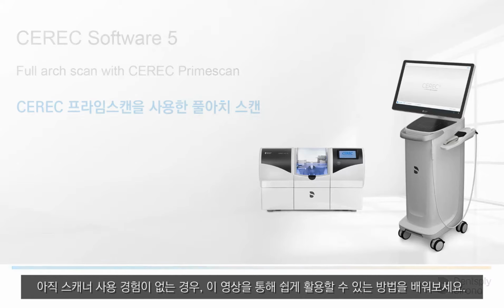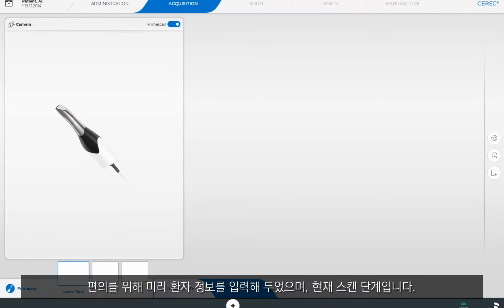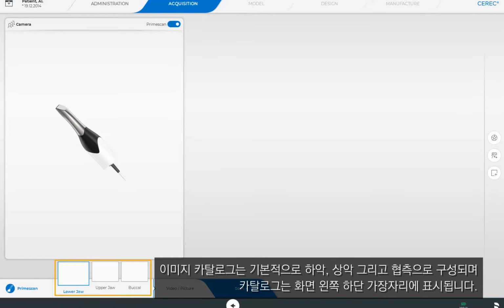works well. We have already set up our patient and the indication. We are now in the acquisition phase. The default image catalogs, lower jaw, upper jaw, and buccal, are displayed at the lower edge of the screen.